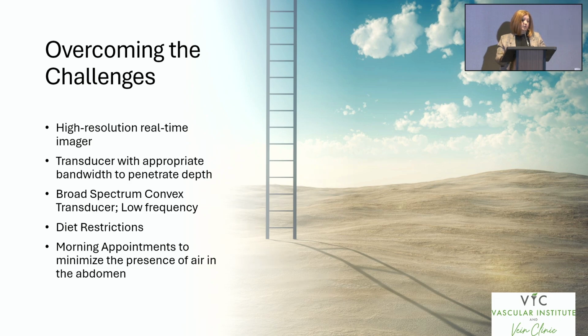So overcoming the challenges, you want to use a high-resolution real-time imager.